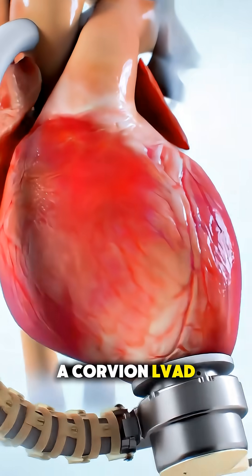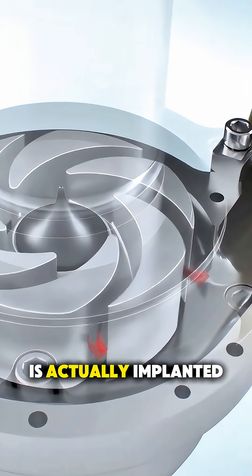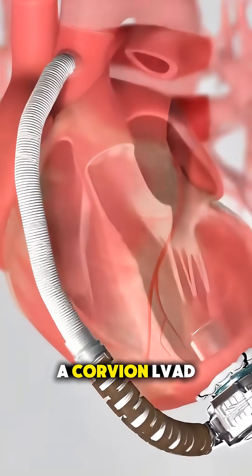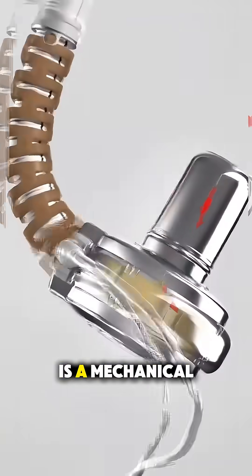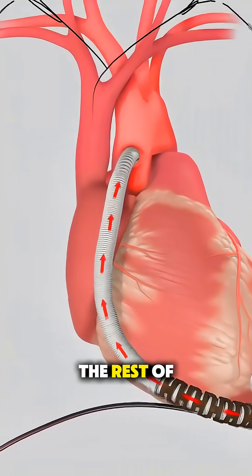Ever wonder how a Corvion LVAD, one of those amazing heart assist pumps, is actually implanted? A Corvion LVAD is a mechanical pump designed to help a weakened heart push blood to the rest of the body.